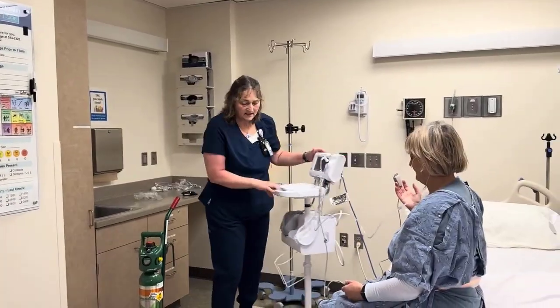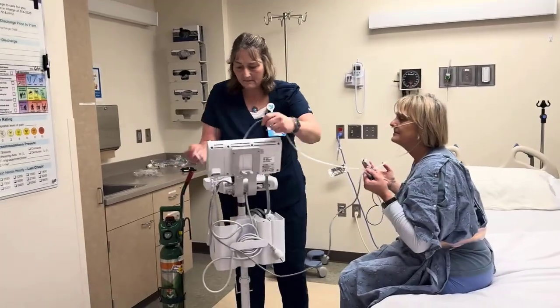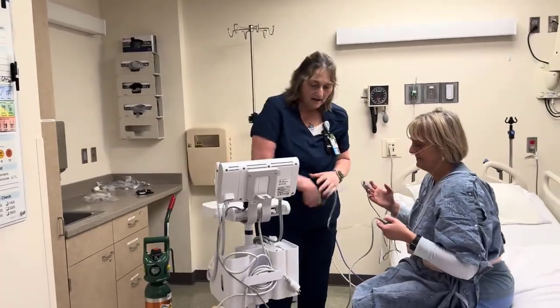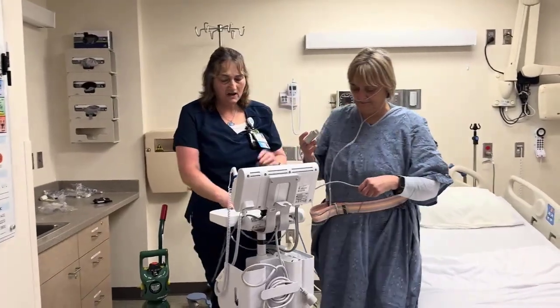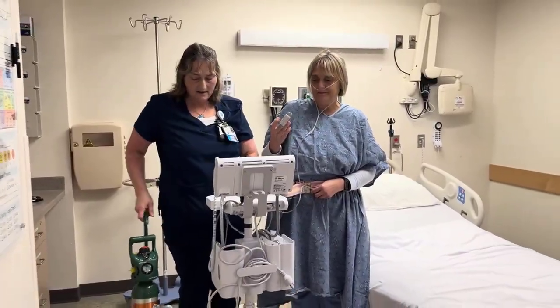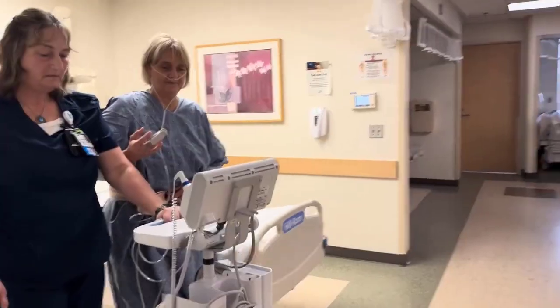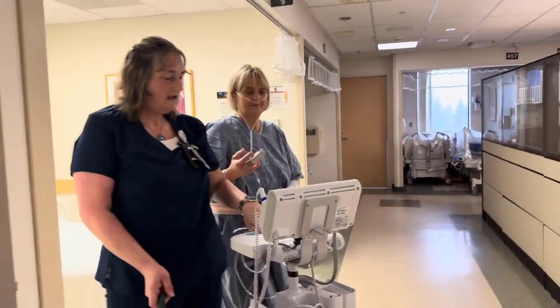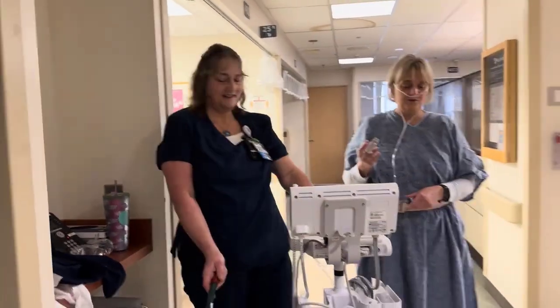All right, let me get this in front of you here. Okay, sorry about that. Get you turned around. Make sure you got enough slack here. Thank you very much, nice job. Okay, so we're just going to walk down the hallway to the right here, and we're going to walk about as far as your mailbox would be. And we don't have to walk very fast. How are you doing? I'm doing good. Good.